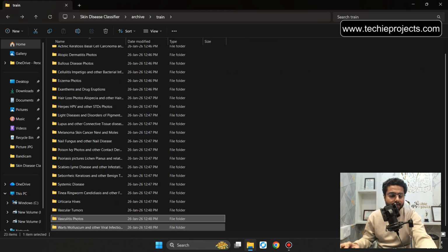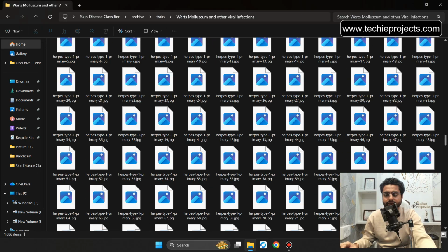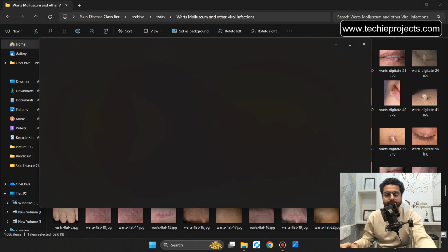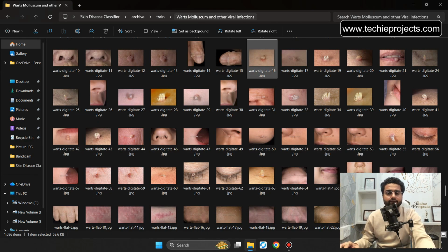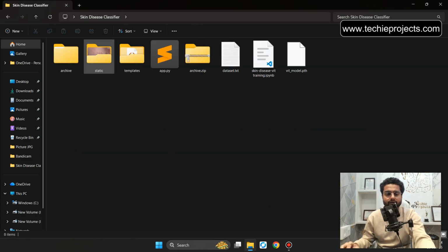Let's go back. The last one, warts, molluscum, and other viral infections. It will be around 1086 images. Let's scroll down. So it looks like that. Let's go back. So this will be the dataset folder, and the other will be the static folder.